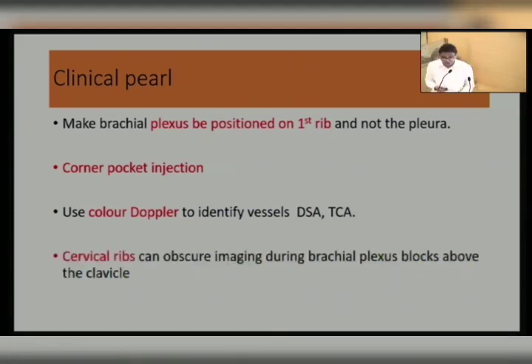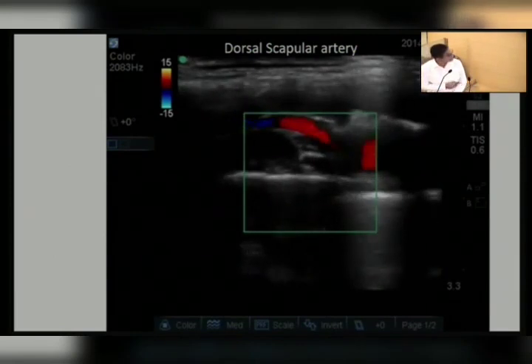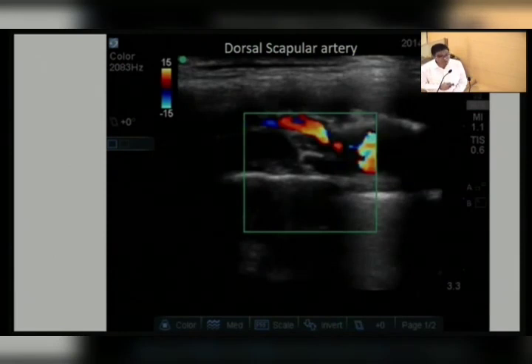And sometimes cervical ribs, which are present in 5% of the population, can be a reason for your brachial plexus block failure, because trunks are divided with the presence of cervical ribs. You can see one of my videos on YouTube regarding this cervical rib. This is the dorsal scapular artery arising from the subclavian artery over here, and this is plexus. So you need to avoid these arteries while doing the block.